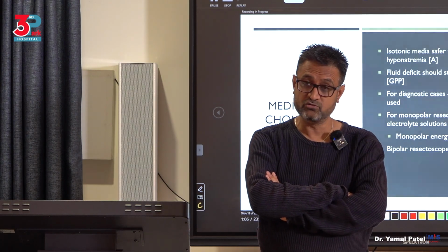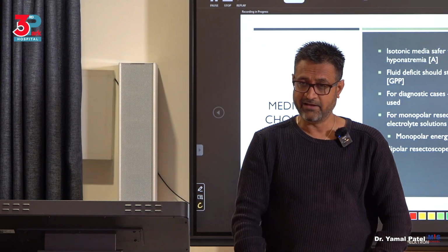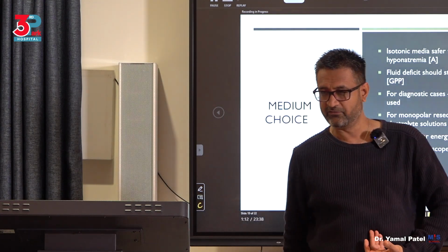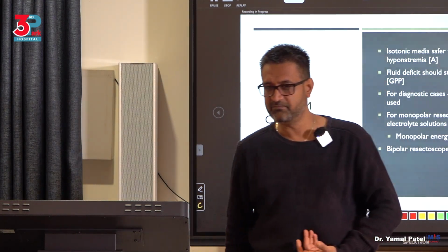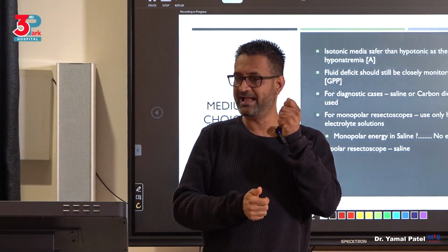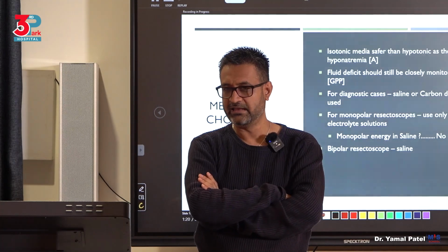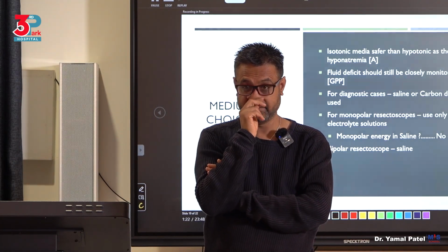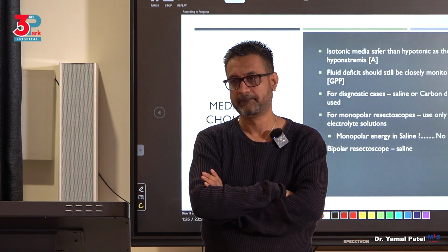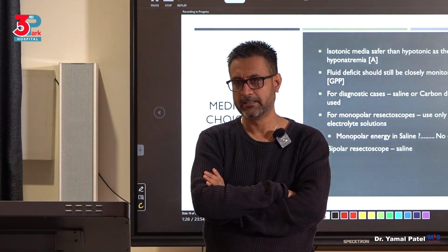So when I use saline, I will be pushing electricity into the patient, and it will be looking for this return plate, wanting to go back to the machine. So what will happen if I activate monopolar inside a patient's uterus with saline? Anybody?